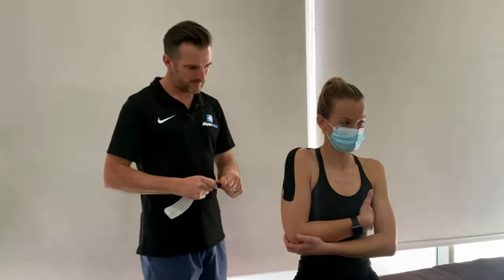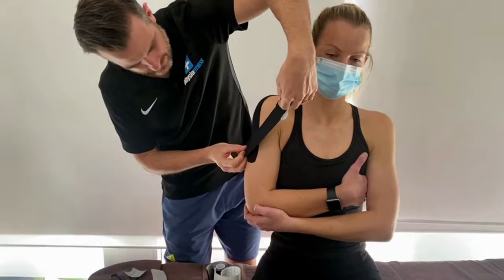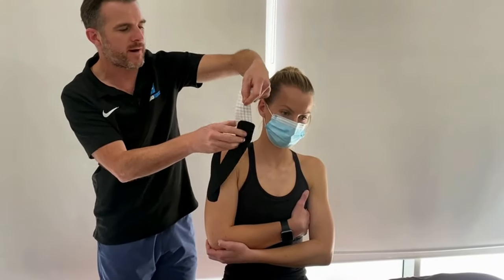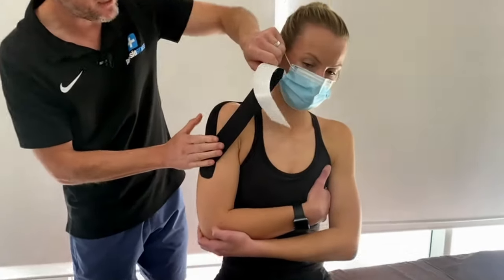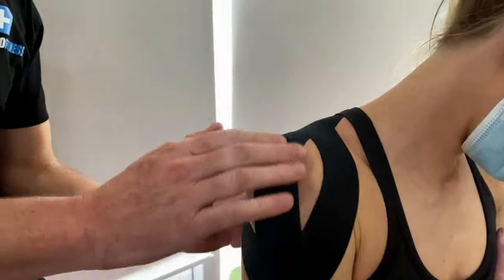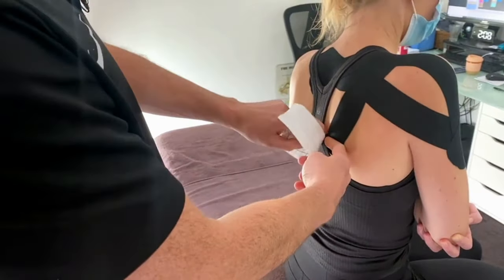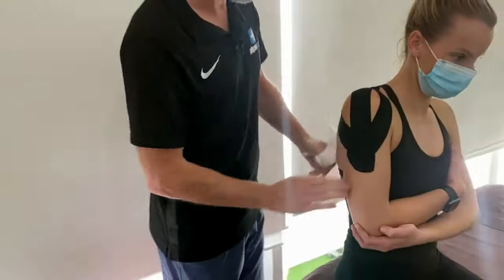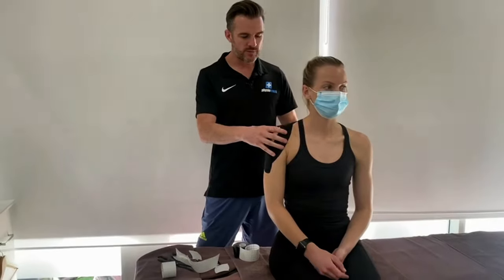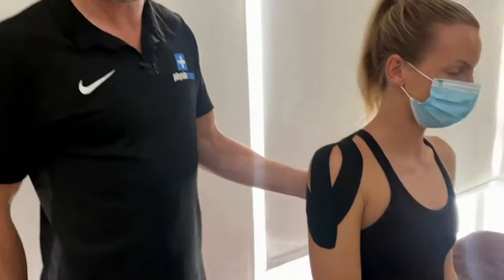The last one is your anterior strip, which comes up and then down the posterior part of that scapula. Come in at about a 45-degree angle, make sure it's nice and flat, then come around the front of that deltoid. You'll cross over the AC joint a little bit here, anchor it down at about the mid-angle of the scapula, and again zero tension at the end. All three together should act like a nice suspension so when she lets her arm go it's held up nicely.